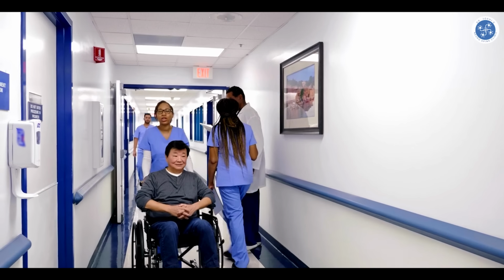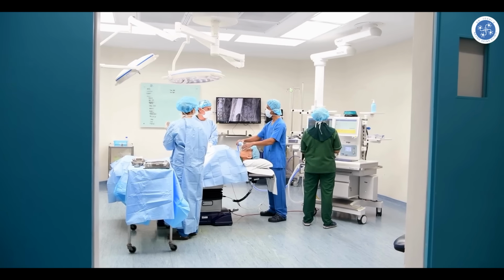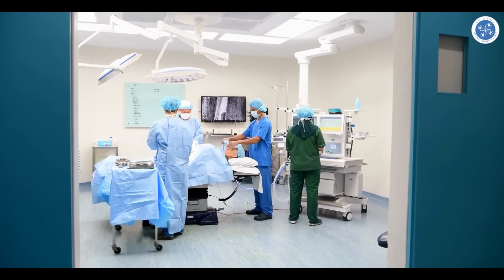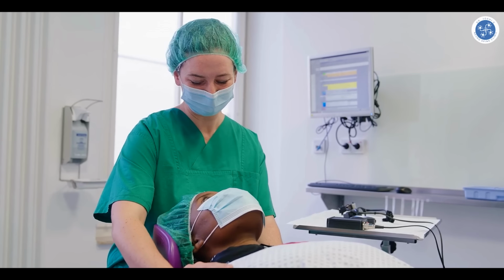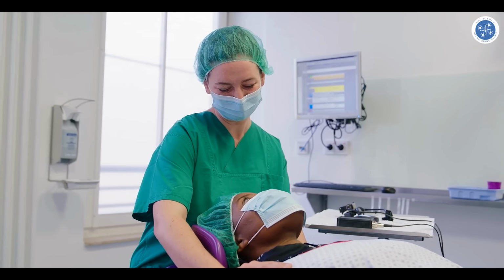The nursing staff will shift you to the operation theatre. They will send all your MRI scan findings and blood reports along with you to the operation theatre. You will be shifted to the operation theatre 1 hour prior to the planned time of the surgery. The surgery is performed under general anesthesia, where you will not be aware of the surgery. You will be made to lie straight on the bed with a support for your head, and a small opening is made on the front of your neck.